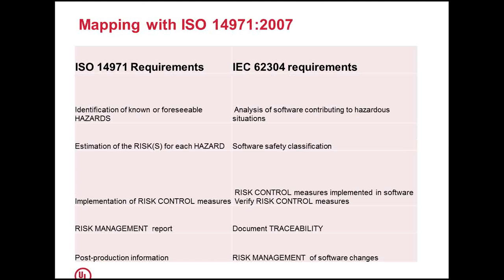Let us see the mapping of requirements with various standards now. Let us start with the risk management standard.